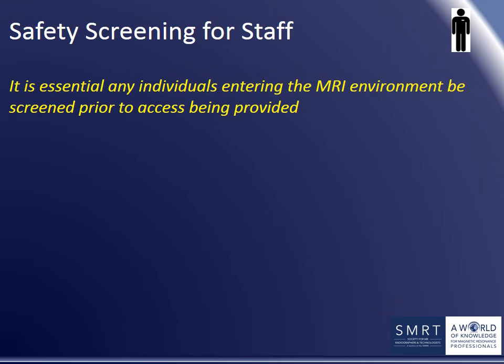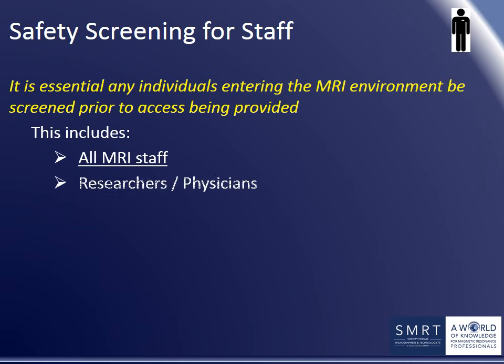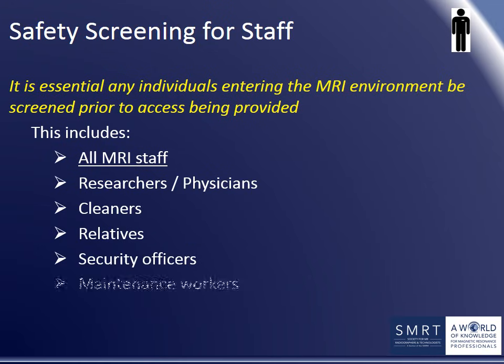Any individual entering the MRI environment must be screened prior to access being provided. This includes MRI staff such as radiographers, technologists, nurses, radiologists, as well as researchers, physicians, cleaners, relatives, security officers, maintenance workers, firefighters, visitors, etc. There are no exceptions.